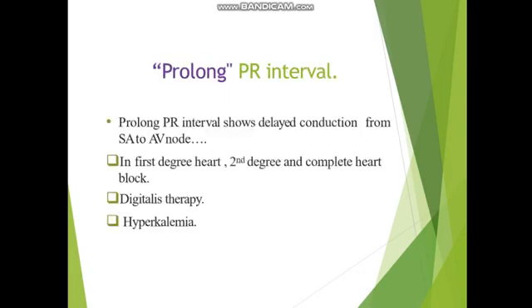Prolonged PR interval, very much important. The students must note, a prolonged PR interval shows delayed conduction from the SA to the AV node. In first degree, second degree and complete heart blocks, and in digitalis therapy and hyperkalemia, you will see the PR interval. It will be delayed. And this is seen in the first degree heart block, second degree heart block, and complete heart block, and also digitalis therapy, digitalis toxicity, and hyperkalemia.